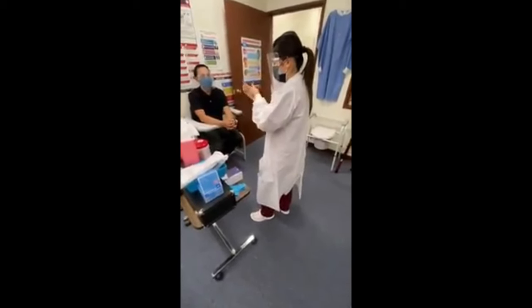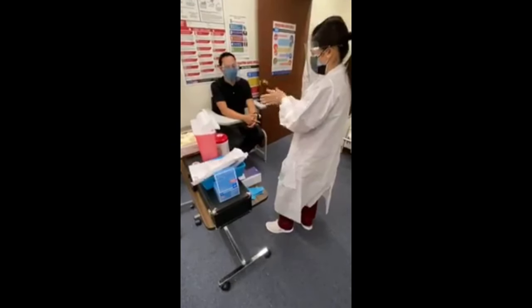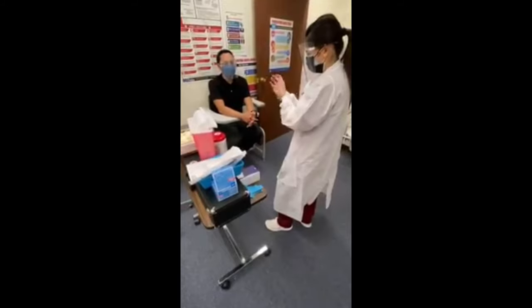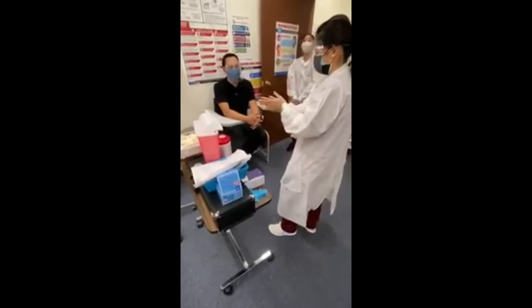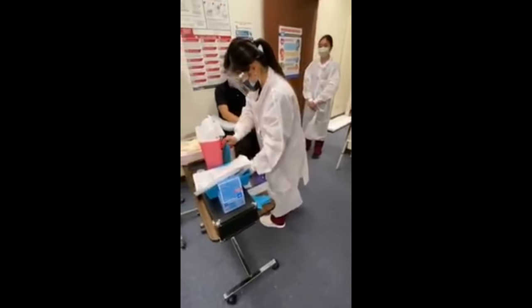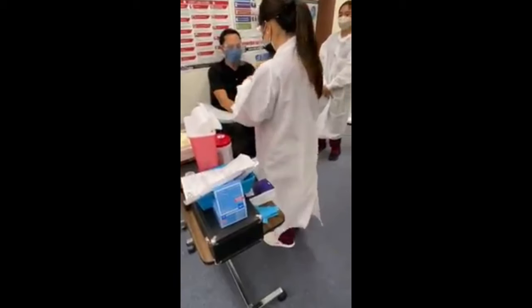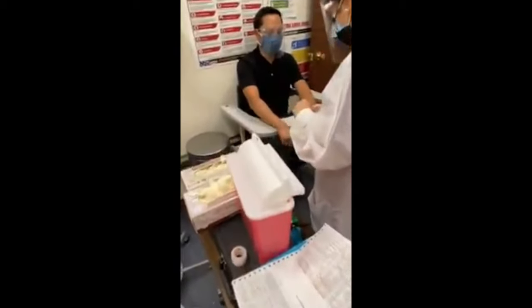Okay. Let me just sanitize. Do you have any allergies to latex? No. Can you see it? You know it's back, right? Yeah. So I'm going to be drawing blood on your hand. Okay. Yeah.